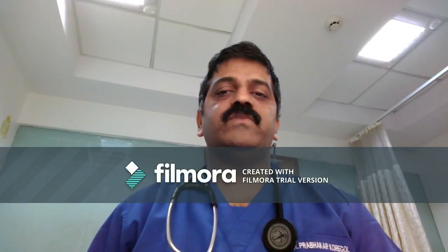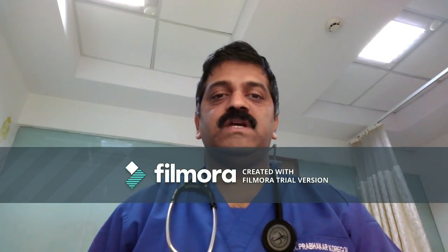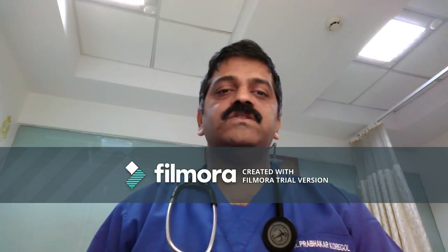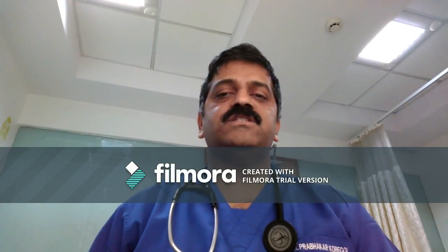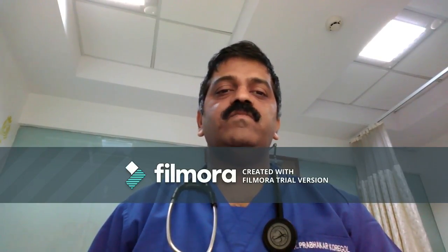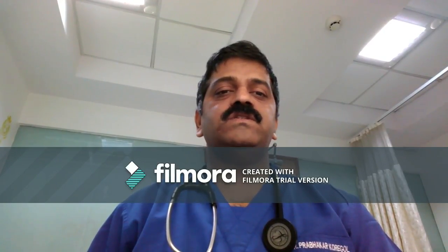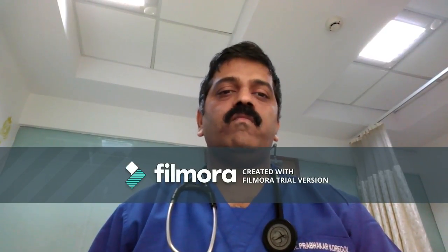There's what's called upsloping ST depressions. These are very non-specific and may or may not be associated with ischemic heart disease, but to be considered significant if you also see an associated history suggestive of an ischemic pain. Then we have what is called horizontal ST depressions, which is most likely to be associated with ischemia, whereas the third variety is called downsloping, which is almost always associated with ischemia to the myocardium.